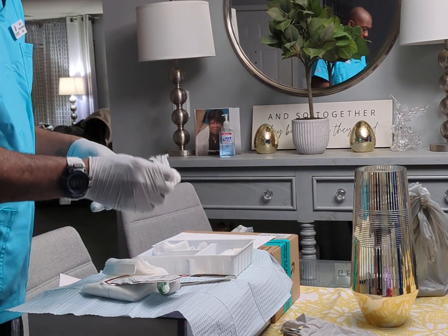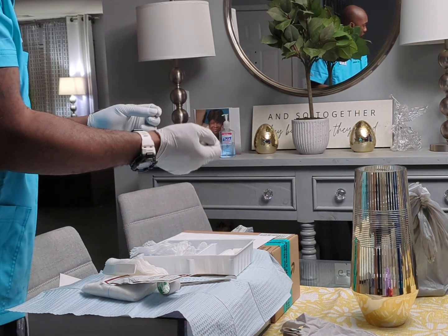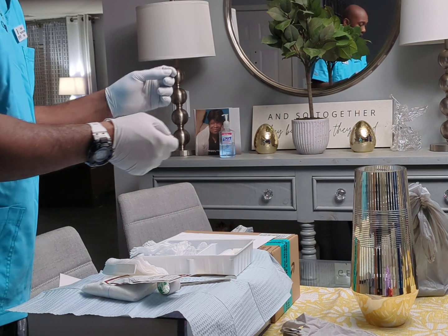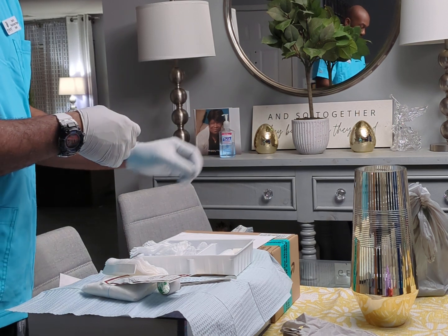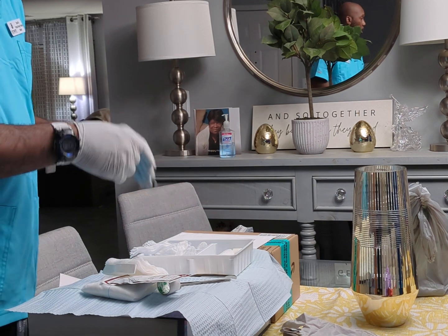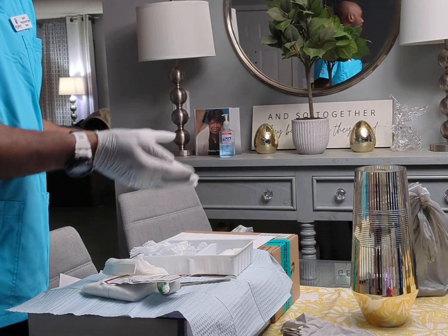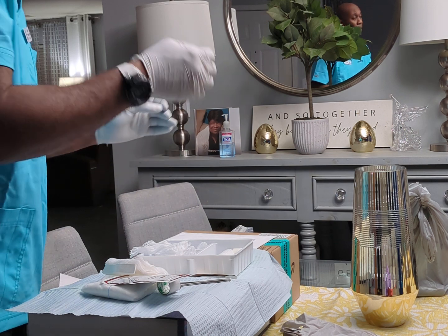Now, if there was any tunneling, we would also pack that. When I was measuring my wound, I checked to see if there was any tunneling. When I touched and looked, I didn't find any, so I have no tunneling to pack.